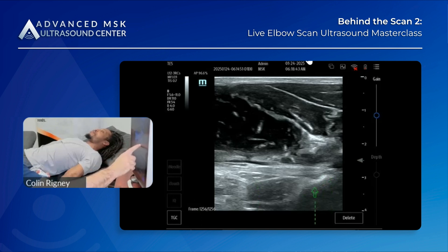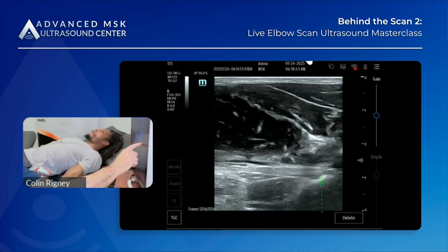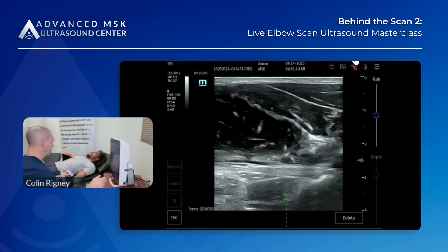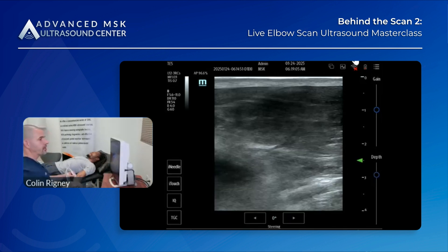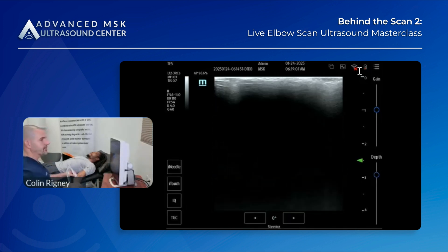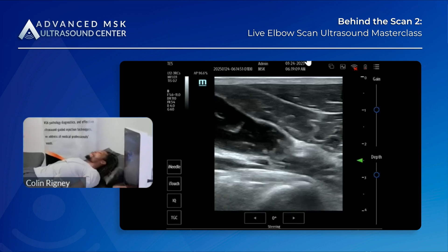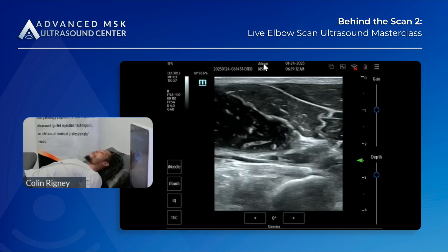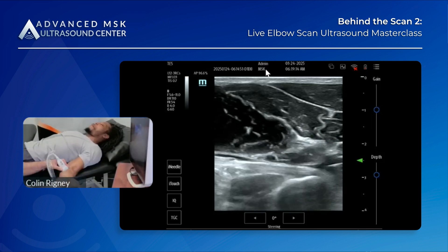The radial tuberosity — as you can see we're not getting quite the same area footprint. I can probably get a little bit more from the footprint width, but this is the bicep brachii and this is the radial tuberosity. I'm going to unfreeze and demonstrate the dynamic element to this window, which is super crucial if you want to see whether it's actually intact or not.